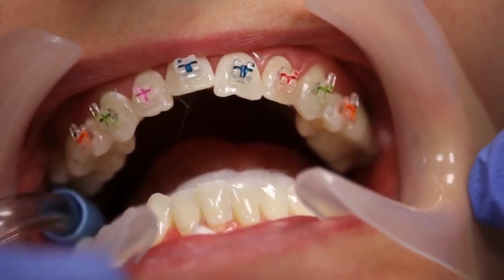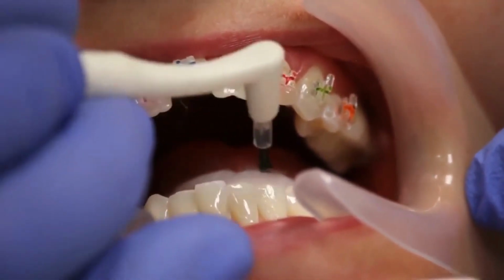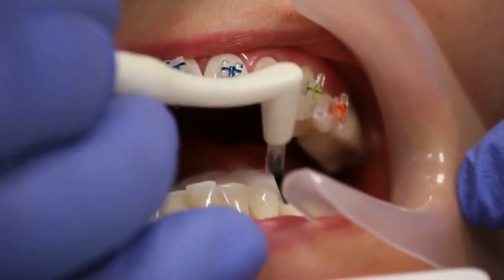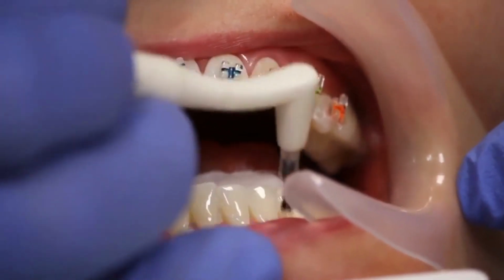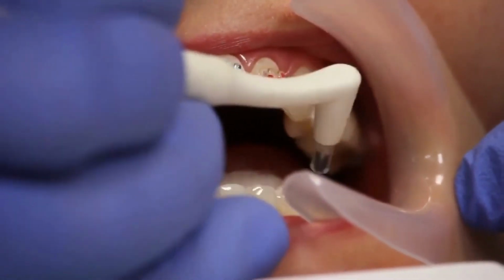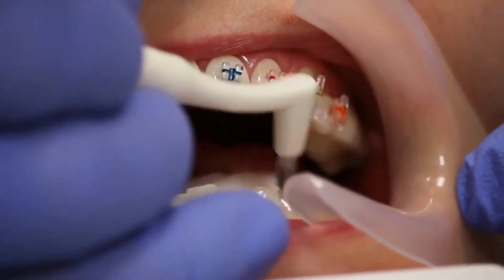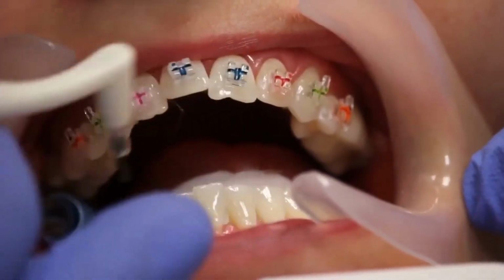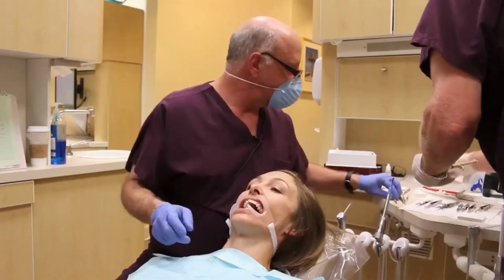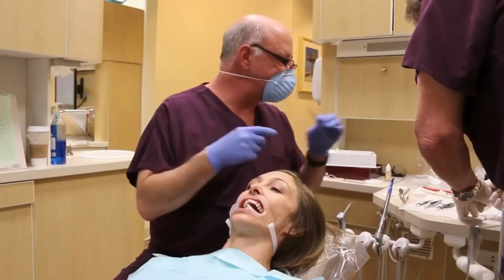If we don't make those adjustments, you will end up with a cant on your occlusal plane as well, or a possible posterior open bite. You will lose control of the vertical. So always remember, we start with the second bicuspid. So again, right to left, please.